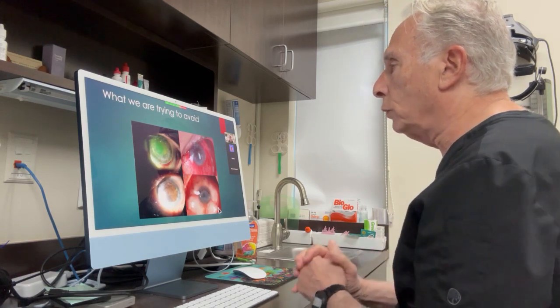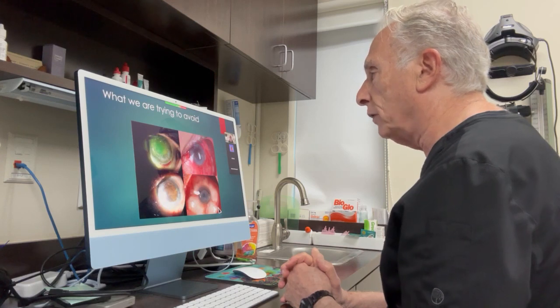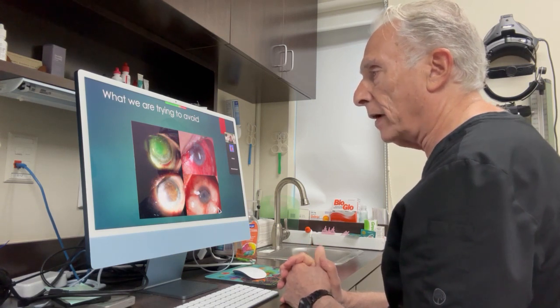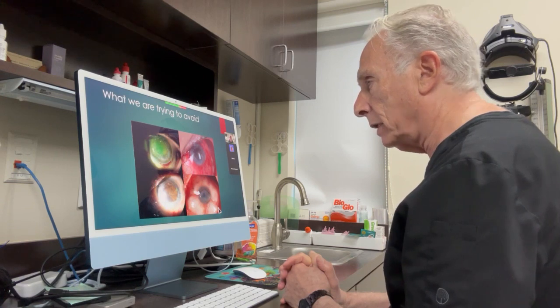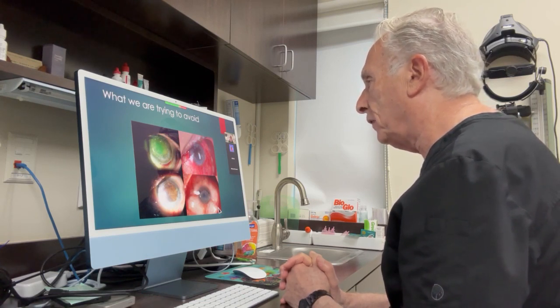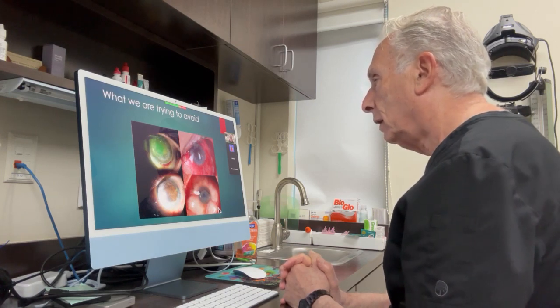And this is what we're trying to avoid. This particular patient underwent a corneal transplant. The first cornea had to be replaced after a week. The second cornea, the eye developed an infection, an endophthalmitis. The anterior chamber collapsed. From the top left photo to the bottom right was a period of about 15 or 16 months. And you can see the sequence of events, what happened.